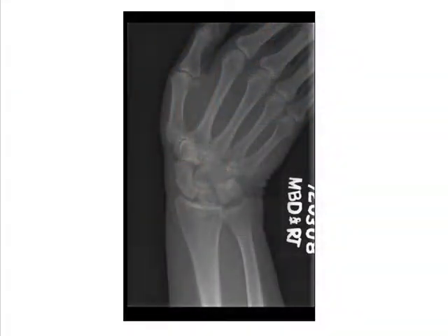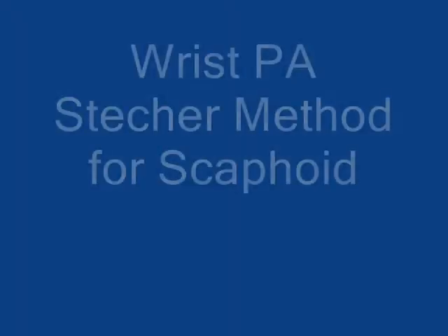The PA wrist radiograph should demonstrate the scaphoid without superimposition, distal radius and ulna, carpals, and proximal half of the metacarpals. Appropriate contrast and density will demonstrate both soft tissue and trabecular pattern of the bone.